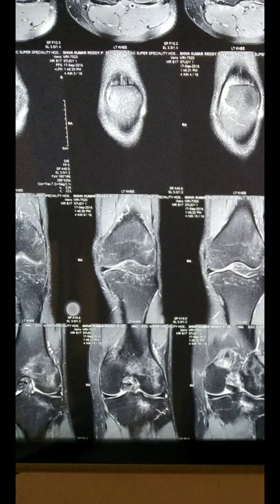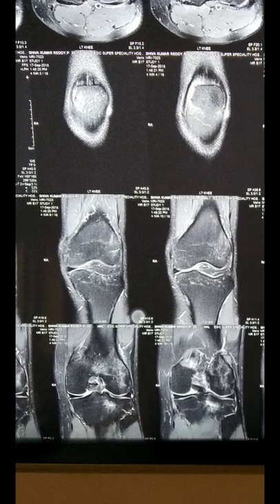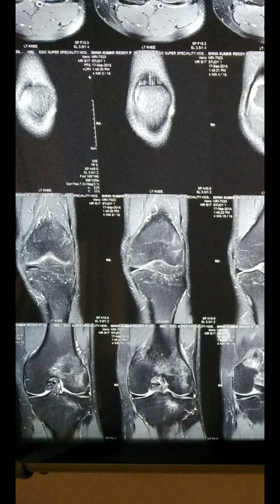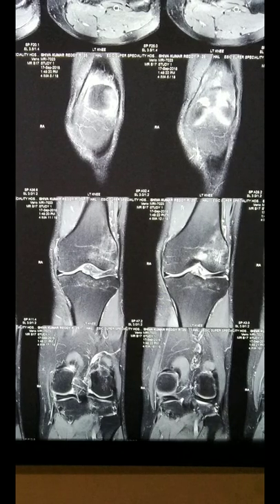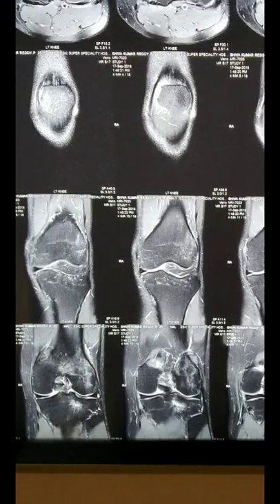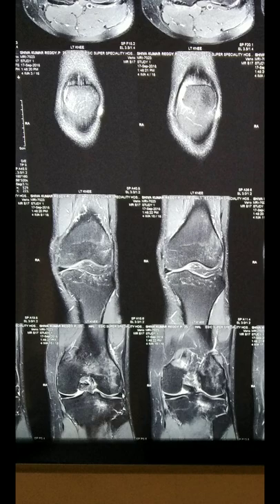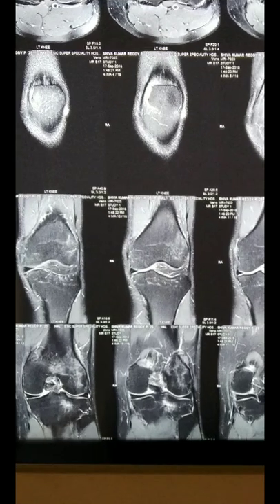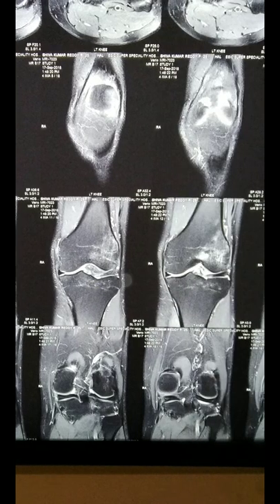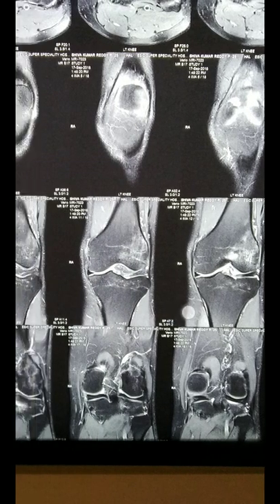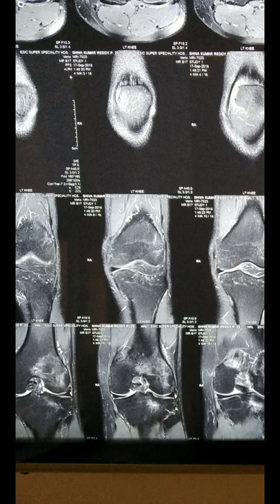Now let us see the coronal cuts. In the coronal cuts, we are going from the front to the back. In the back you will see the fibula, and in the front you will see the anterior horn of the medial and lateral meniscus. This structure is the IT band. And here you can see contusion in the lateral aspect of the femur, which we have already seen in the posterolateral aspect. We are also able to see the PCL.